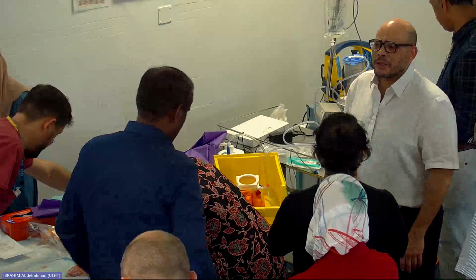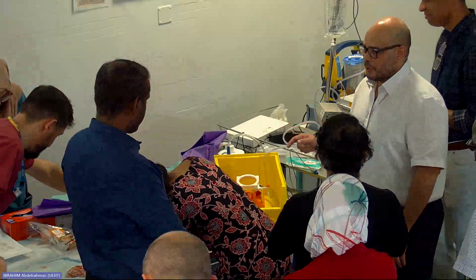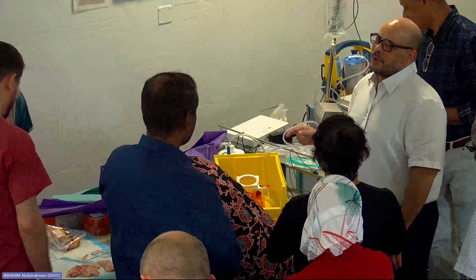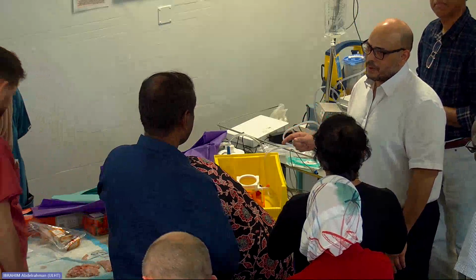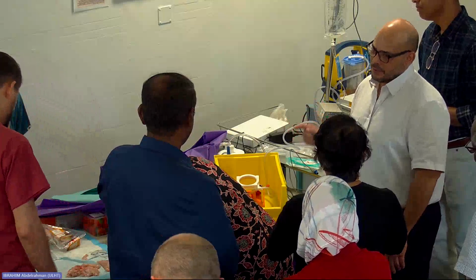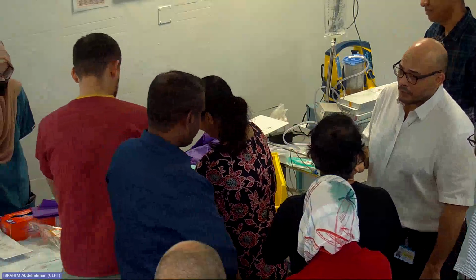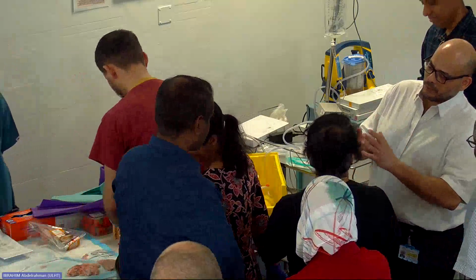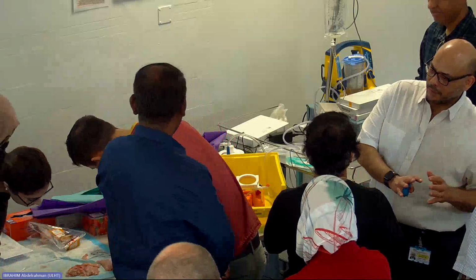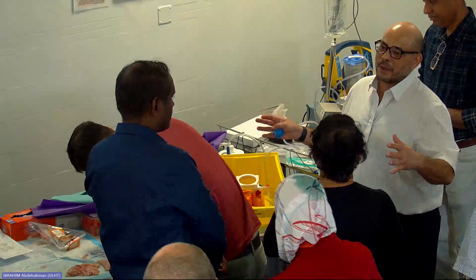This is the other way of thinking, because yes, it's a very nice tool. It's a very good surgery. It's a 5-minute surgery, but you need to be very careful with the application and the patient. This is not a long-lasting surgery, except if you are removing the mucosa from the turbinate forever. Otherwise, in a few months, with the allergies, the mucosa will become big again.